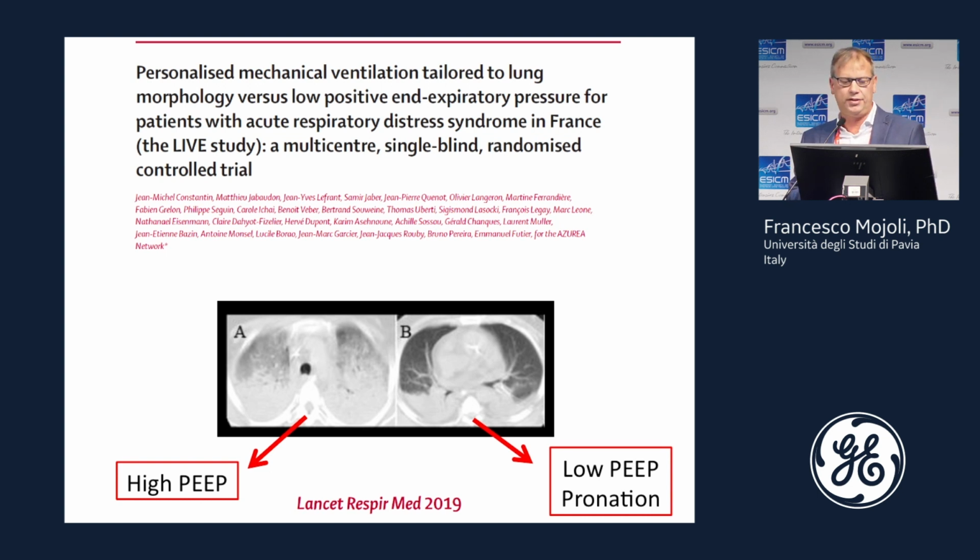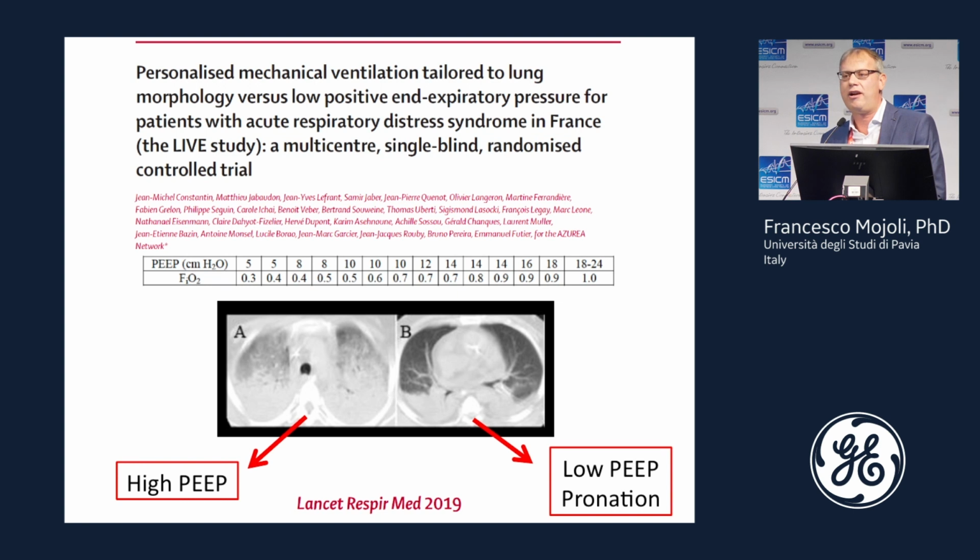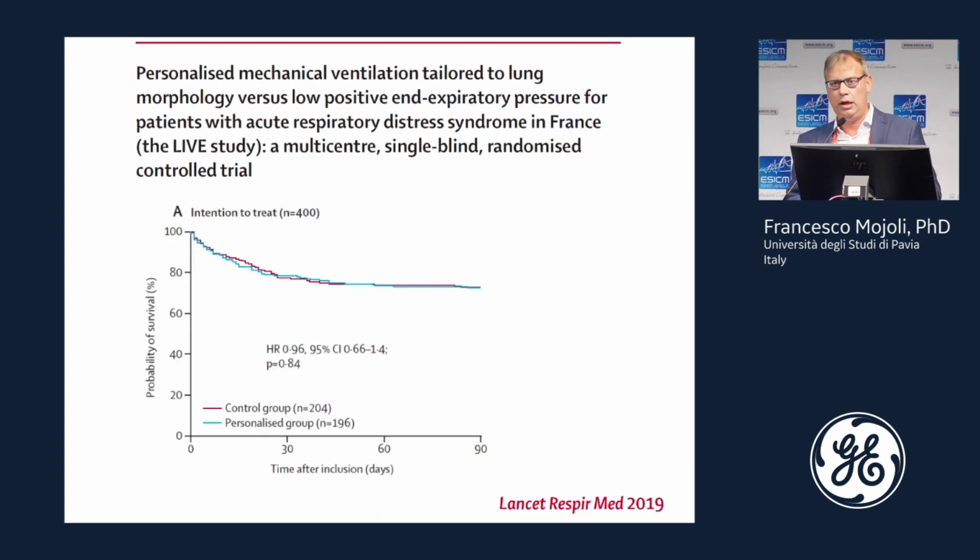In this recent randomized controlled trial, this strategy was compared with a conventional one based on PEEP FiO2 table. Unfortunately, I would say disappointingly, this trial is negative. No difference in outcome was observed between the personalized and the control group.